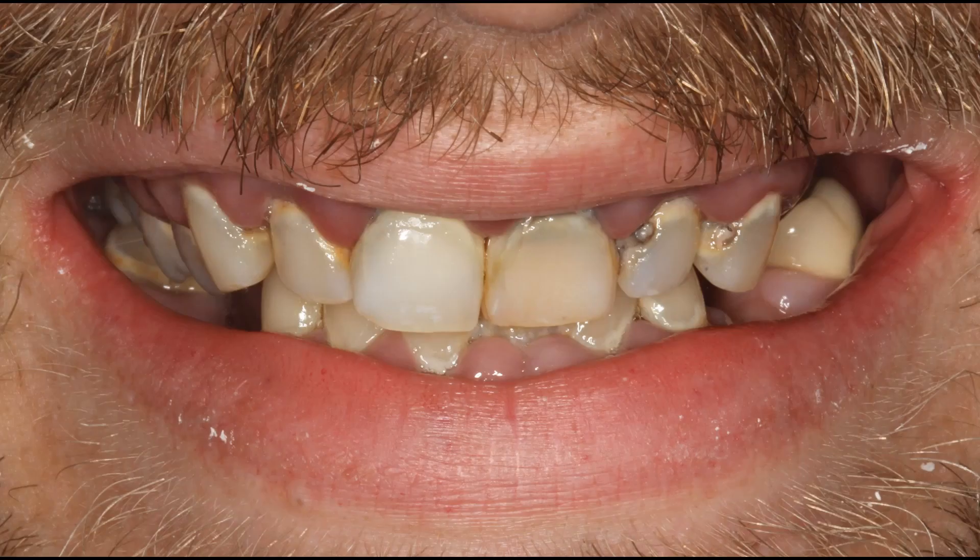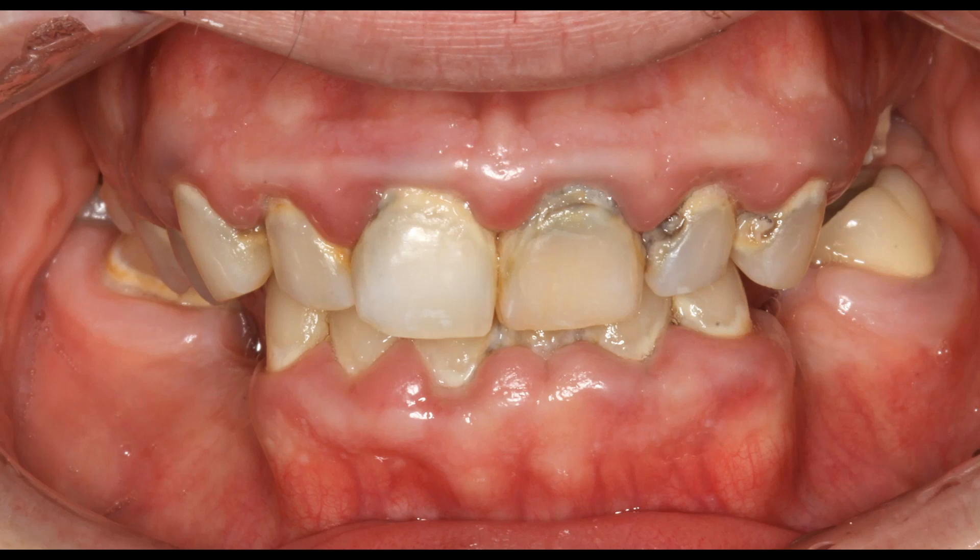Here is that same patient's preoperative photograph. Here's the patient's preoperative smile picture on a close-up view, and it's obvious that he's got quite a bit of decay, but I wanted to point out his papilla and how red and swollen they are. I'm very focused on the interdental papilla — that's what frames the smile, and we want to maintain those tissues as much as we can. This is a very interesting case of how these become healthy and how we maintain them throughout treatment. Here is the lips-retracted view, showing a little bit more detail of the diseased tissues and the extent of them — those are the areas I want you to focus on throughout this presentation.